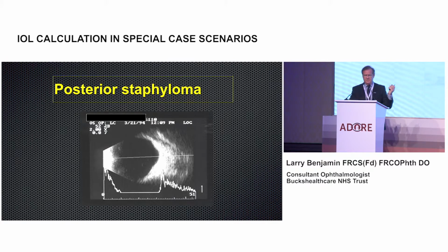Now this was about 15 or 20 years ago, and they didn't make -20 or even -15 implants. They made -10 was the lowest they made. So we had a long discussion about where we were going to try and leave her when she got a cataract. We did the surgery. I said she was going to come out probably -8 or something, and her glasses would be a bit lighter, but she'd be happy. And she came out 6/6 unaided, emmetropic.